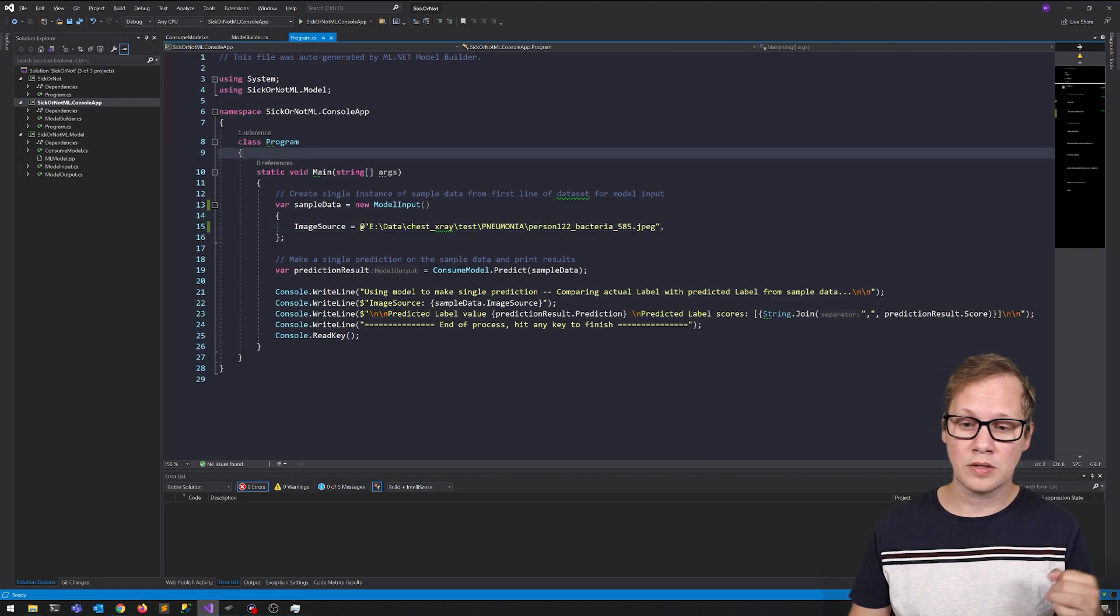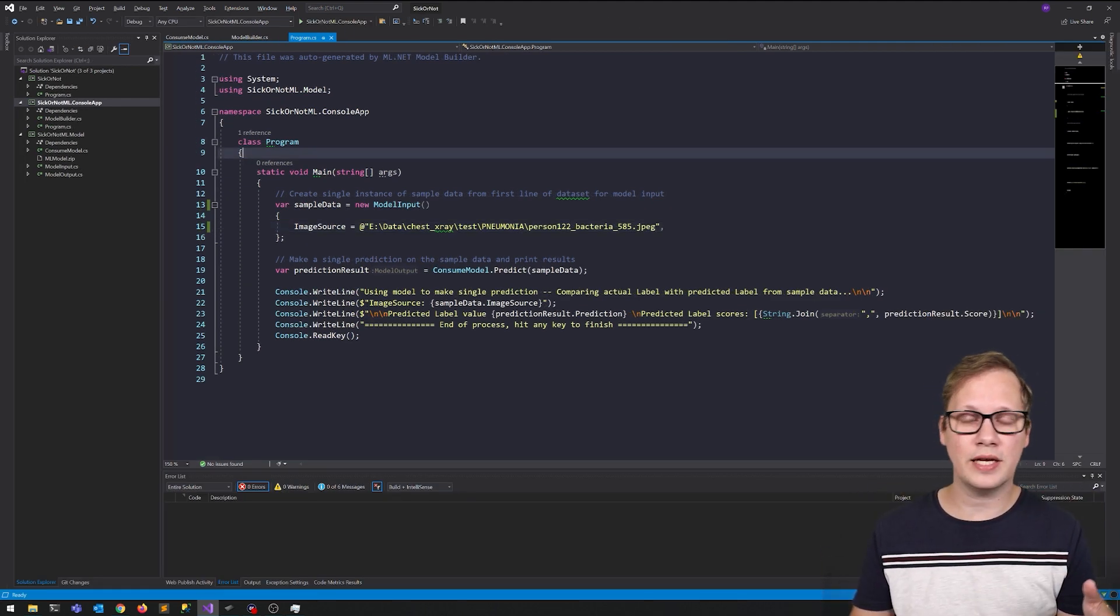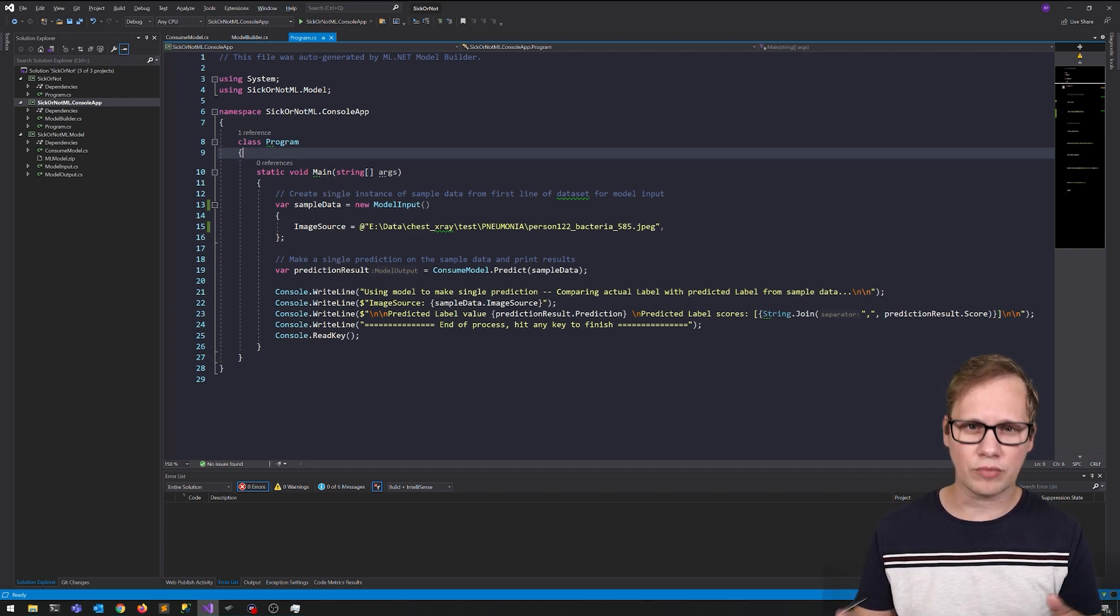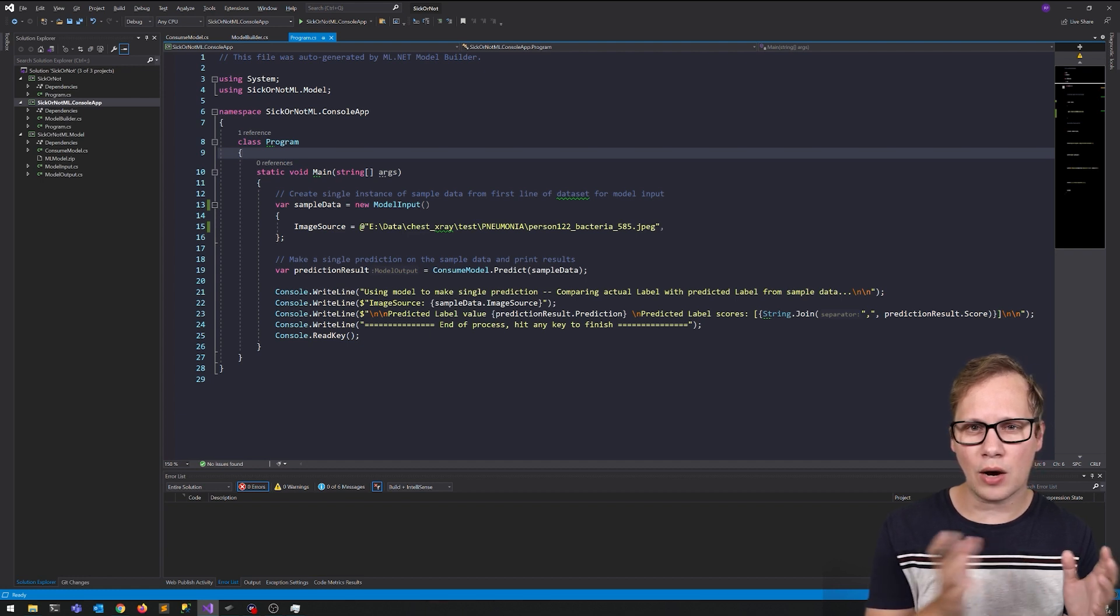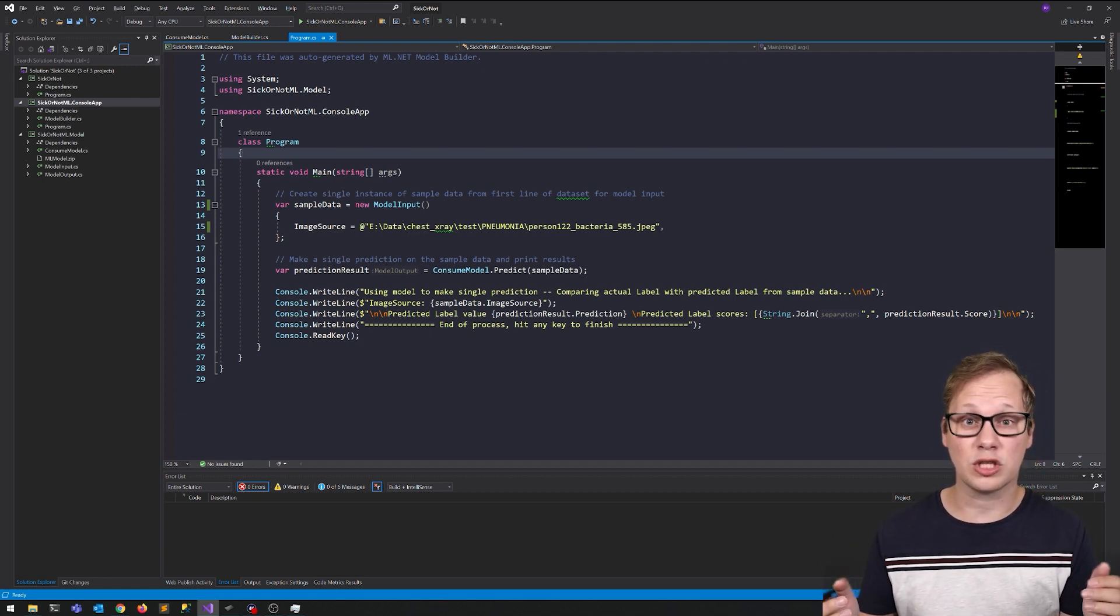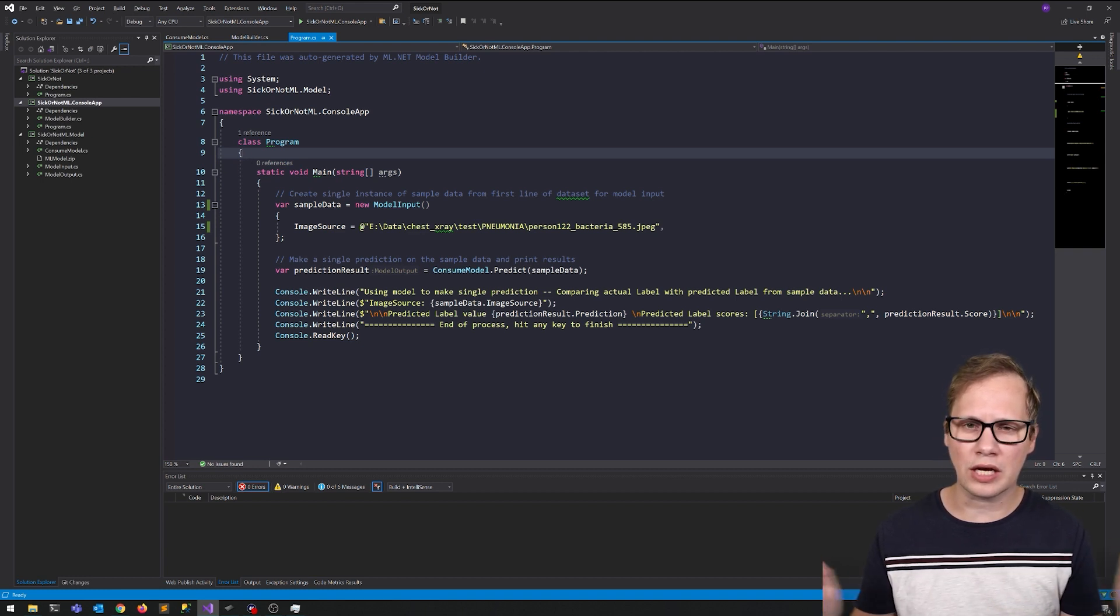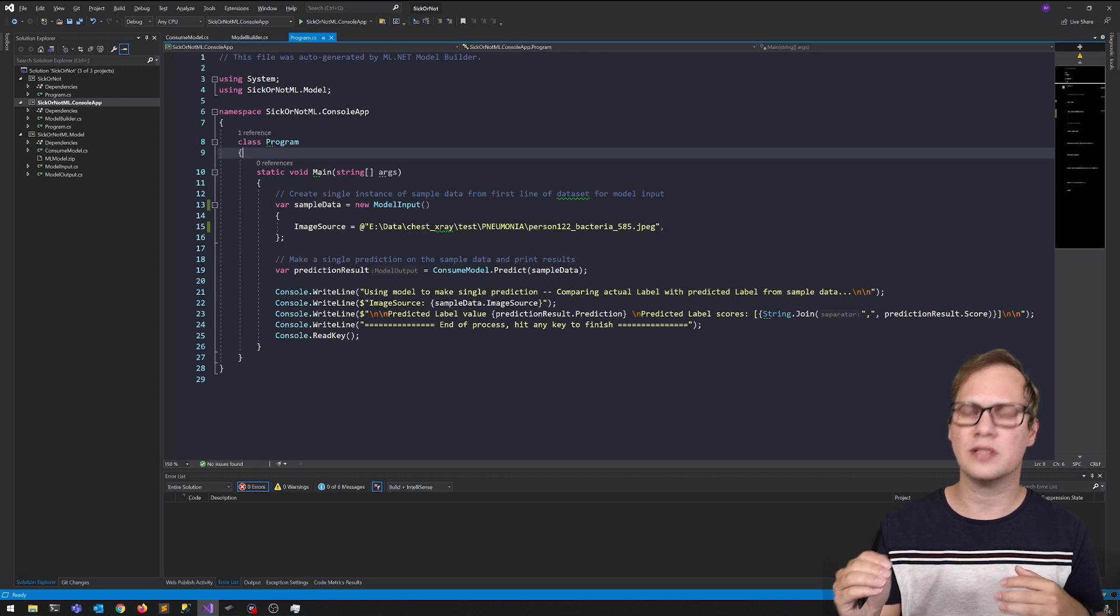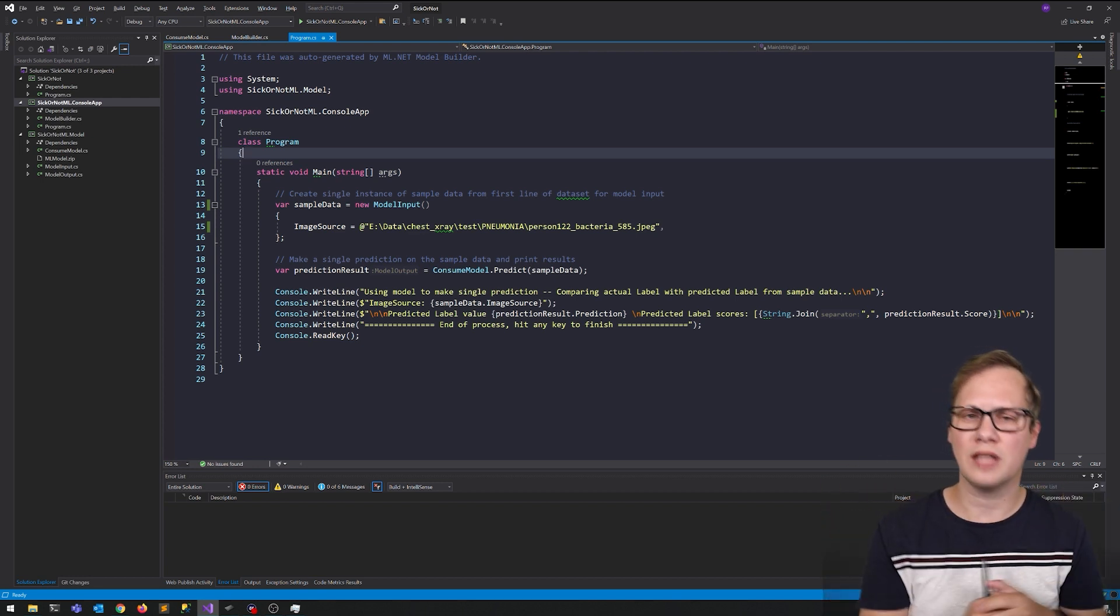So let's test this one. And again, it comes back as pneumonia with 99% confidence. So for example, within a hospital, you could use a piece of software like this to make a first educated guess based on software whether or not this is a case of pneumonia or that it's just something else.